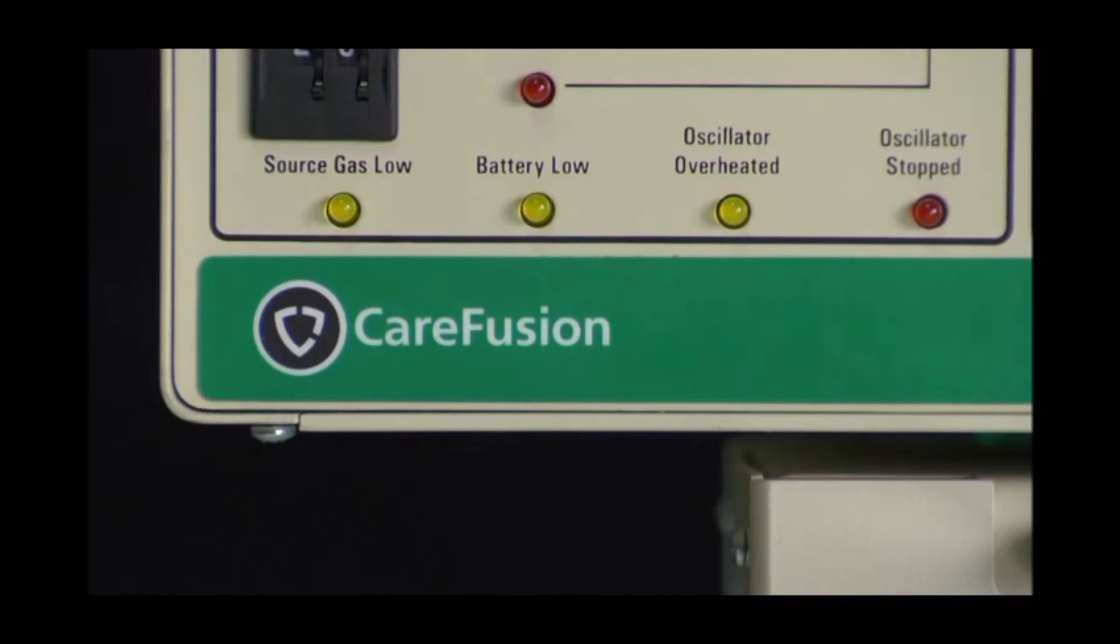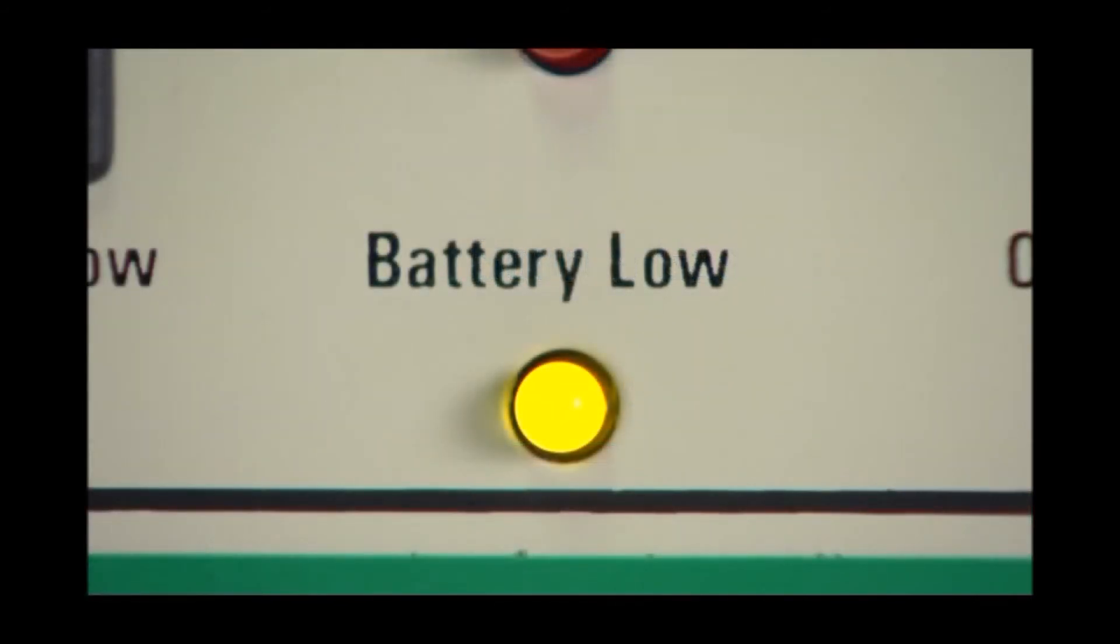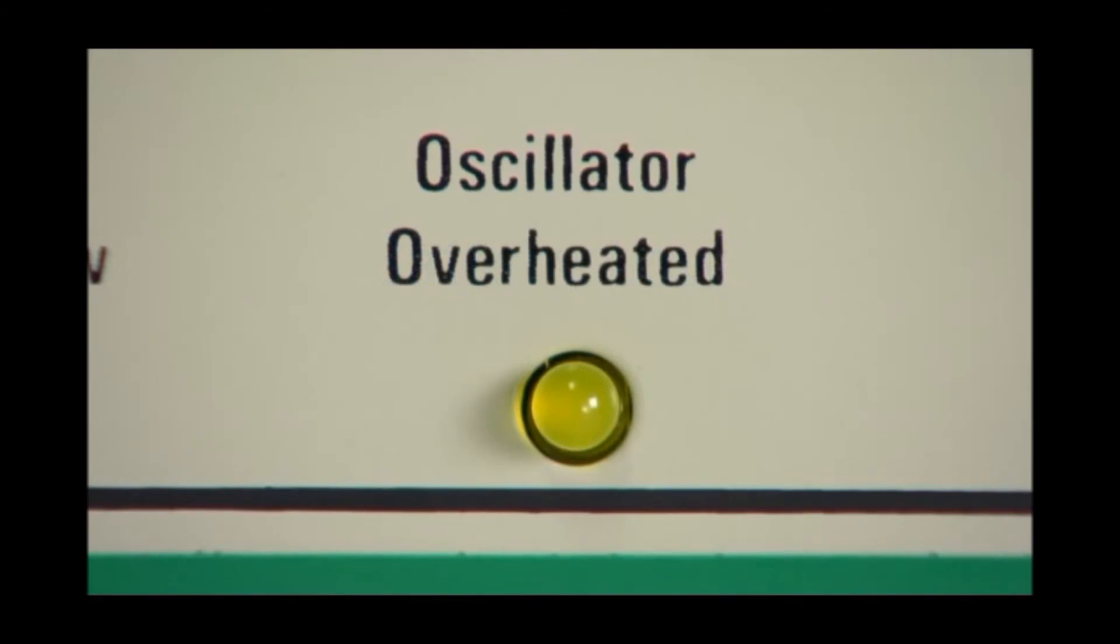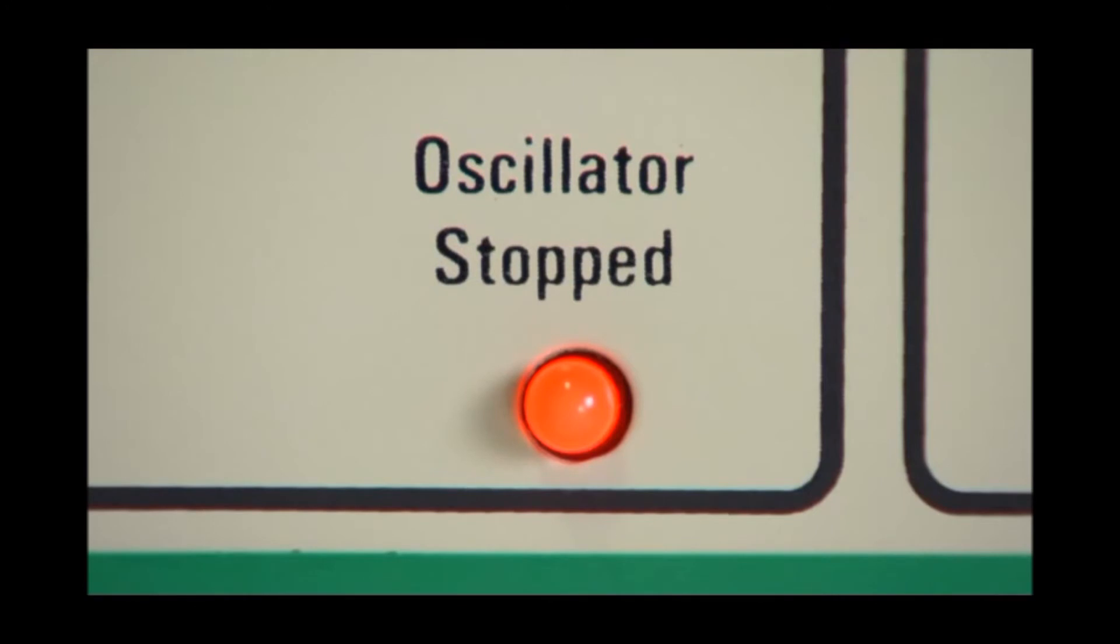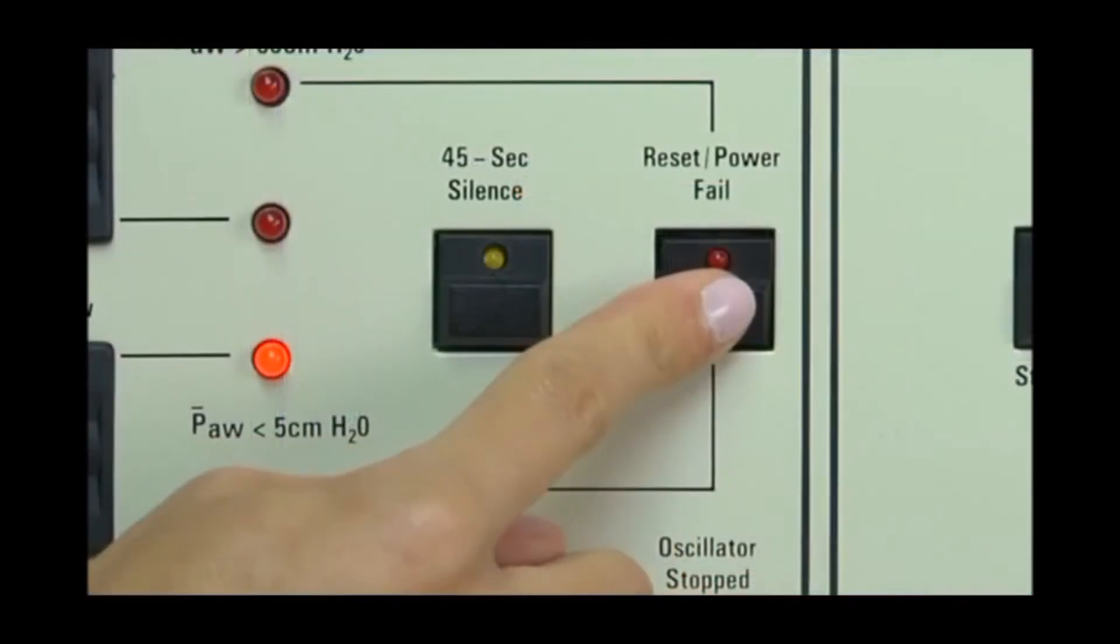These three yellow LEDs are caution indicators with no accompanying audible alarm. This LED indicates a low source gas condition of less than 30 PSI for either of the high pressure gas inlets. The battery low LED means that the power failure alarm battery located in the rear panel of the ventilator must be changed. The oscillator overheated LED signals that the internal oscillator coil temperature has reached approximately 150 degrees Celsius. The oscillator stopped indicator means that the oscillator system is enabled, but the amplitude is less than or equal to 7 cm of water pressure. An audible tone will accompany this red indicator and will automatically reset once the alarm condition no longer exists.